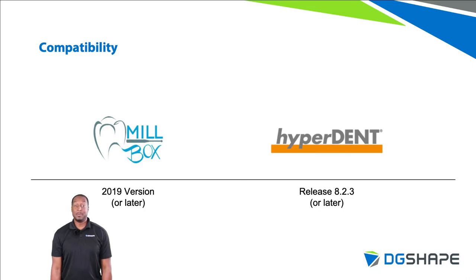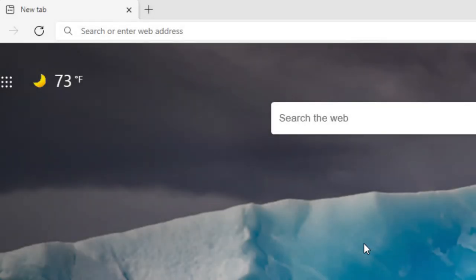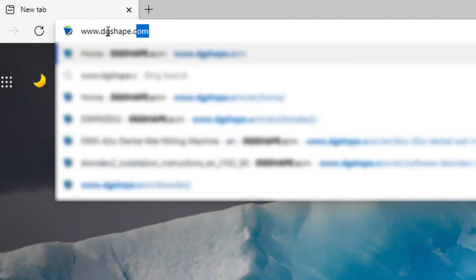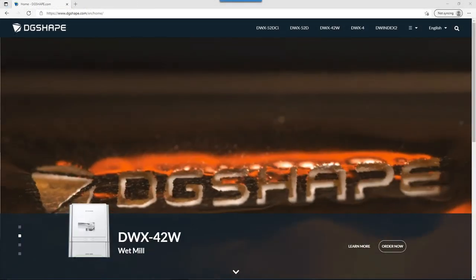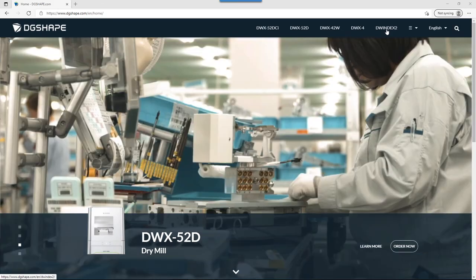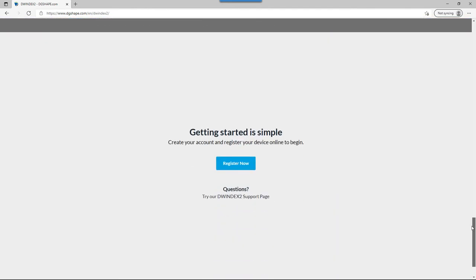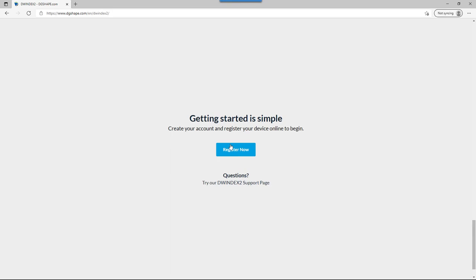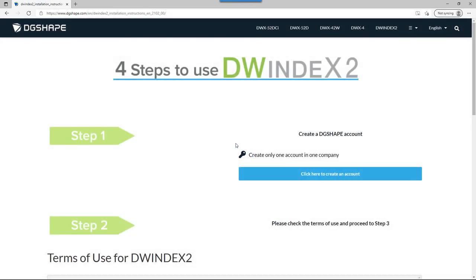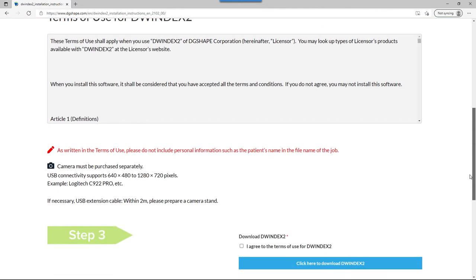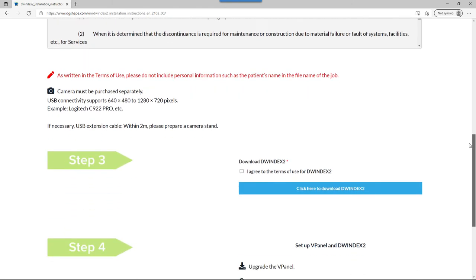Now that you know how to keep your milling center up and running, you may be wondering how to get started using the software. To register for DW Index 2, open your web browser and go to www.dgshape.com. Once on the home page, click on the DW Index 2 link in the top navigation bar. Next, scroll down to the bottom of the page and click on Register Now. Finally, complete each step by creating a username and password, accepting the terms and conditions, and downloading the installation software.